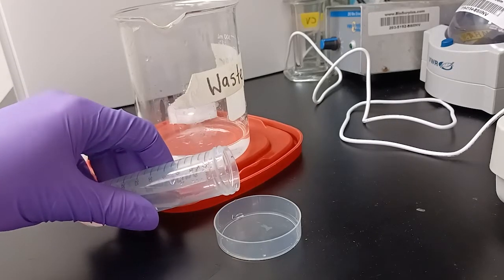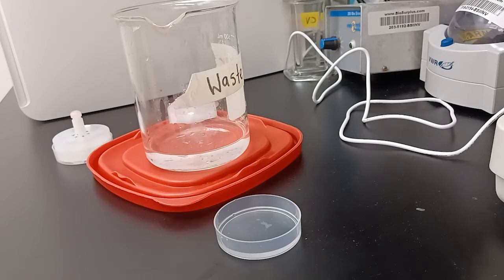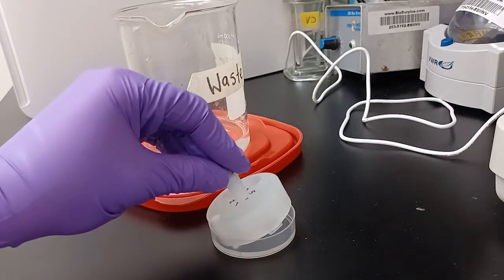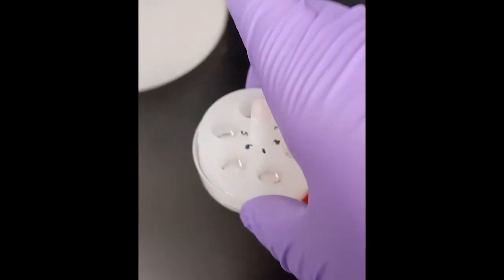We still have two more rinses to do, however. Pour new 1x PBS solution into all three basins, reinsert the netwell inserts, place them all back on the shaker, and turn the speed to slow.